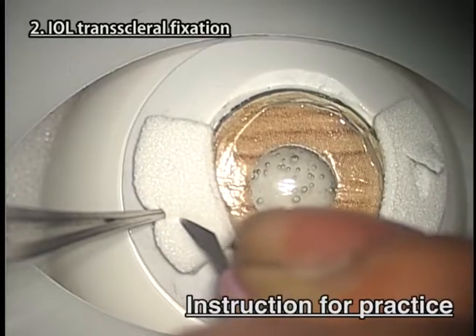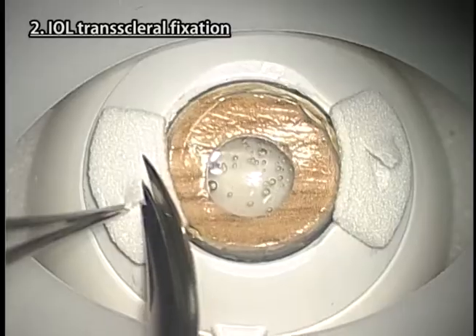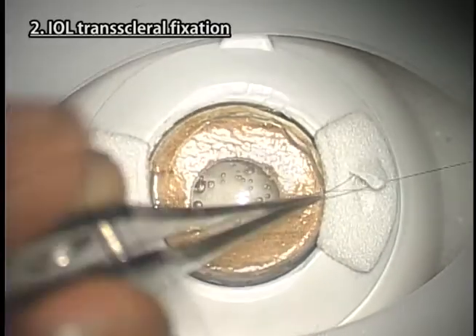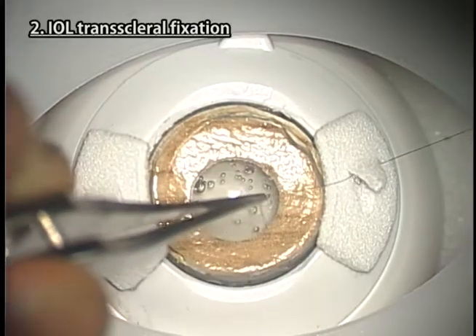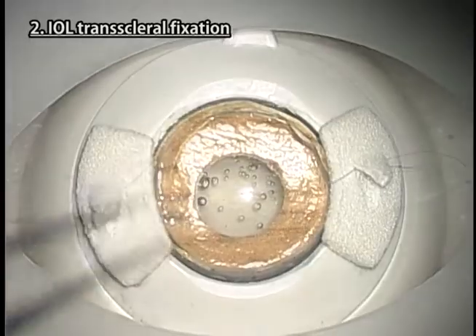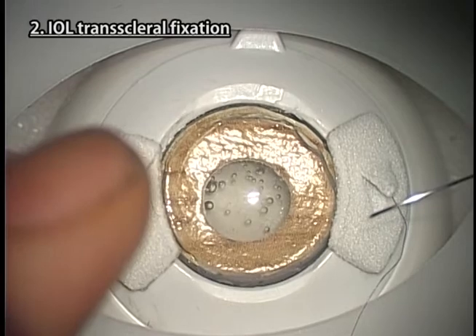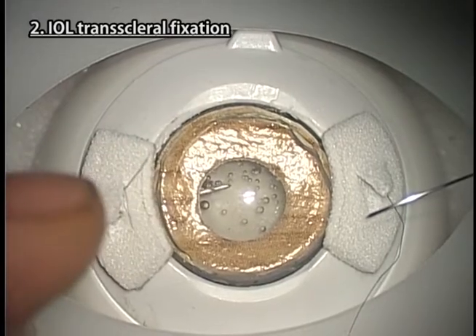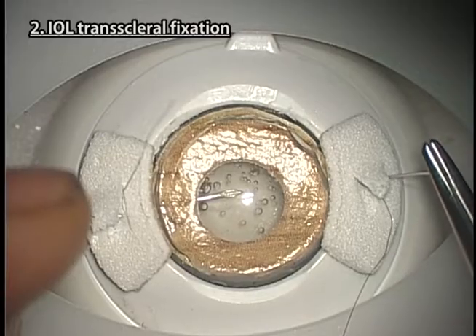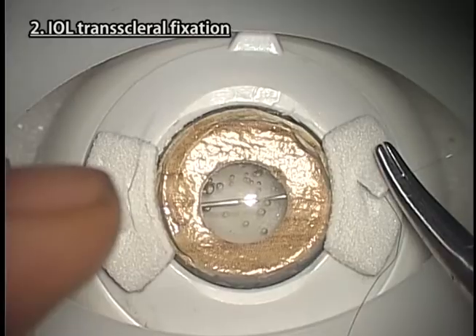Instructions for practice. Make scleral flaps or incisions to bury the sutures. Practice various techniques of transcleral suture fixation of IOL. You can also practice the latest technique of sutureless intrascleral IOL fixation.